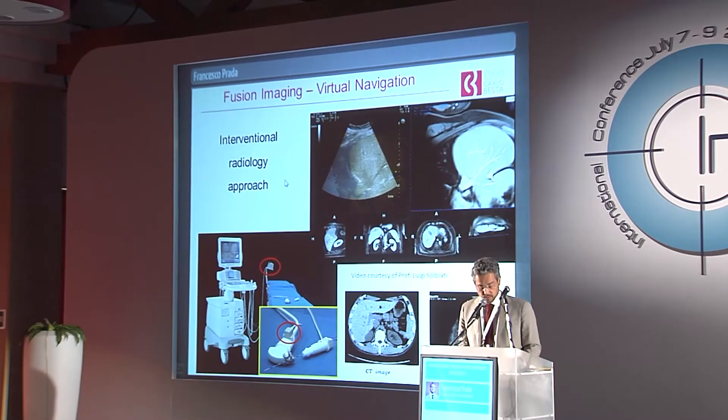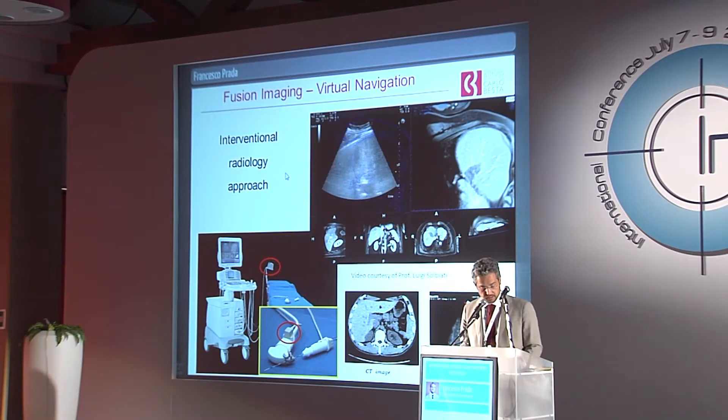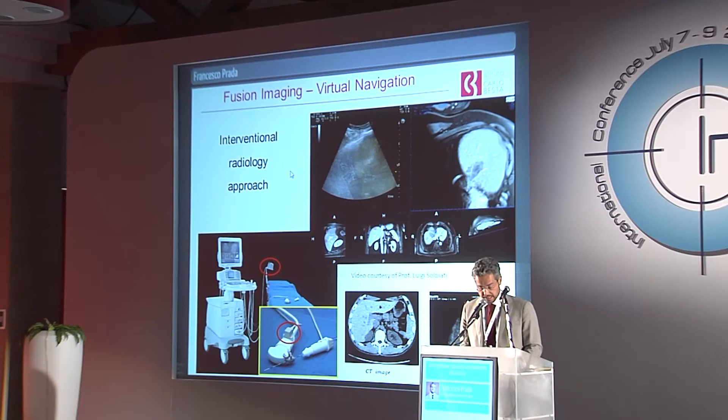We adopted this technology from Dr. Solbiati, who showed us this technique in 2009. This allowed us to put together the positive aspects of both neuronavigation and intraoperative ultrasound, so we can have good spatial resolution, a panoramic view, and an updated image dataset. We use a last-generation ultrasound machine equipped with an electromagnetic system for navigation, which is coupled to an antenna mounted both on the pointer and on the ultrasound probe, so we can use the probe to navigate within the 3D frame.